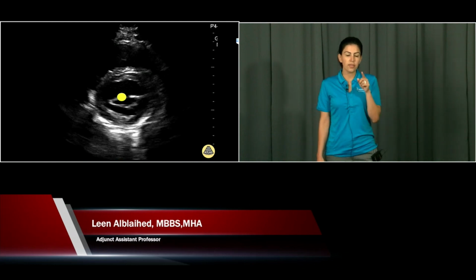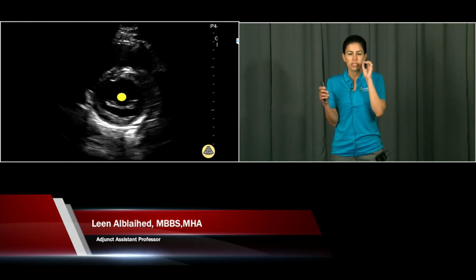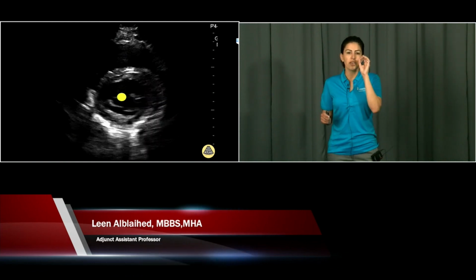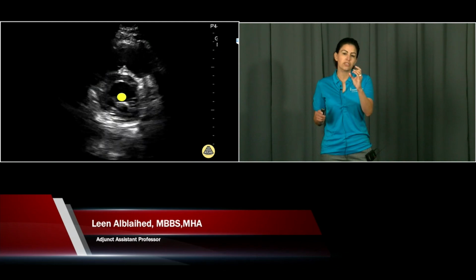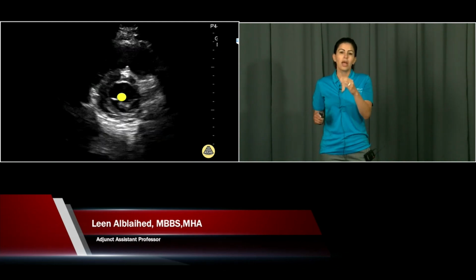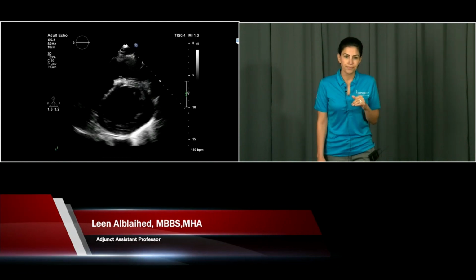I'll show you. And then the other thing I liked is that if you're looking at your ultrasound screen, just put your finger in the middle or a pen, and you want to see the walls of the myocardium concentrically move towards your finger. And that kind of just helps you visualize if there's any abnormality.